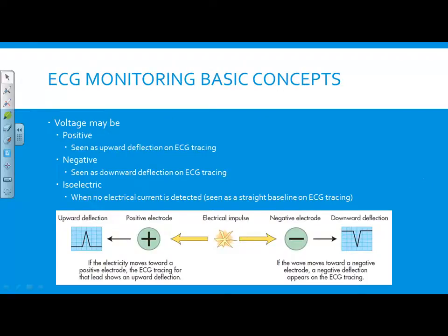Voltage. When we look at the monitor, when we look at the rhythm, what we're seeing is a depiction of the voltage that is being generated by the action potential of the myocardial cell. The action potential of the myocardial cell.